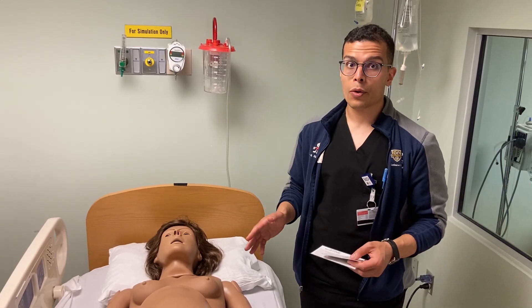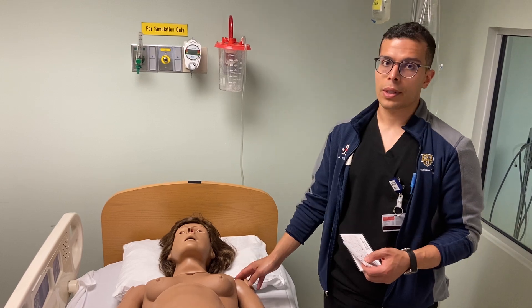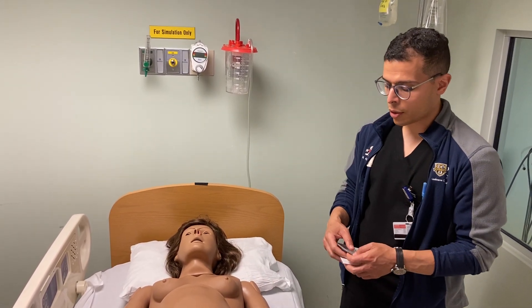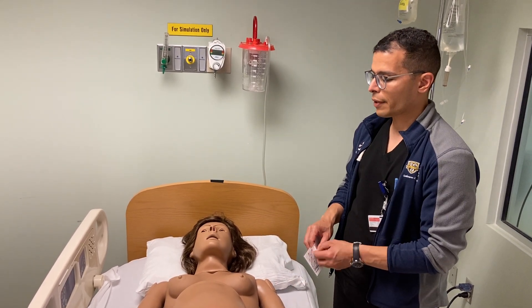Hey guys, so real quick we'll go through how to place EKG leads in an adolescent female or woman and how to navigate breast tissue. Normally of course they'll be covered up and they'll be wearing a bra or something to that effect.